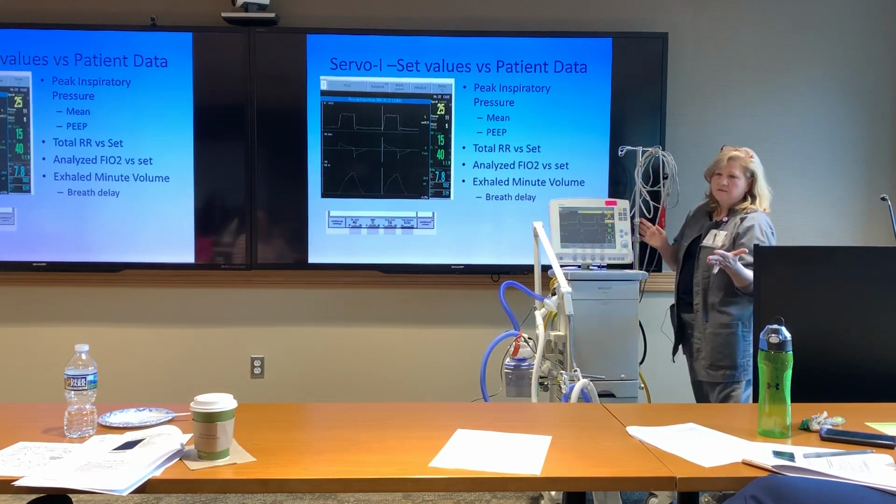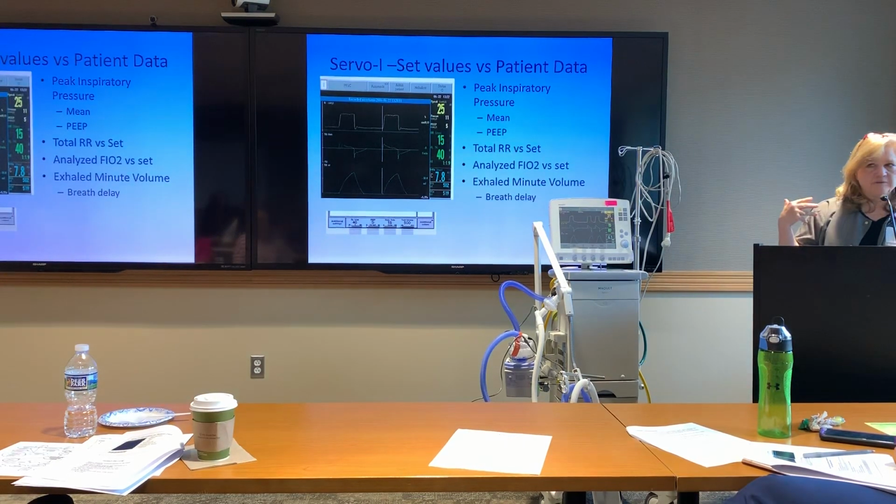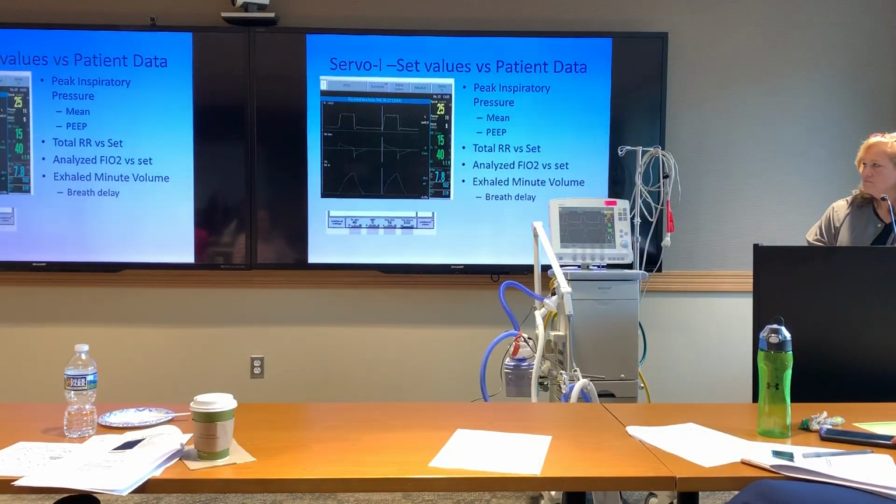So if you have a patient who requires more than 60% oxygen and you're going to turn him, call your friendly respiratory therapist in there, and they can monitor the airway while you're turning, and they can turn the ventilator up to 100% while you're turning, because it is far easier to prevent somebody from desatting during a turn than it is to fix it after they've desatted, okay? So if we can just put them on 100 for the turn, get them stabilized, they can watch the airway. Anybody on more than 60%, you're going to want to get some extra help in there for a turn. Do that, and then when the turn is done, we can stabilize him, put him back on his regular FiO2, and everything's groovy. So I really encourage you guys to just seek help for those kind of patients.